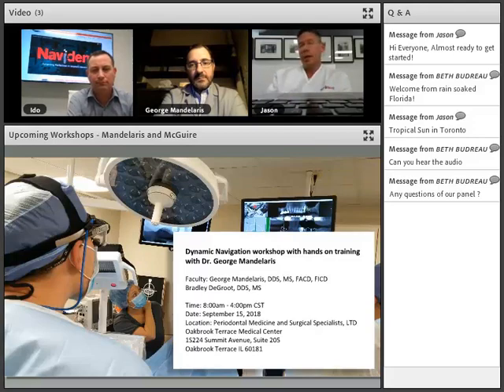But the beauty of it is you can do 3, check your accuracy check. If you're not happy with it, you can do 4. And certainly if you're placing that many implants, you're probably willing to take the time to ensure that everything's going to be perfect for the patient.